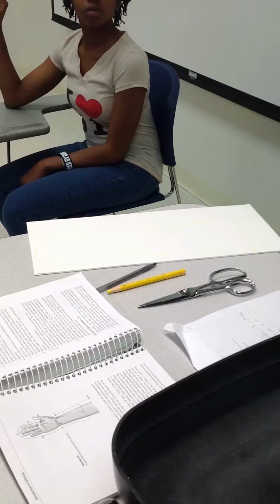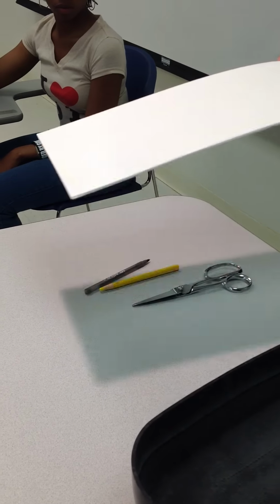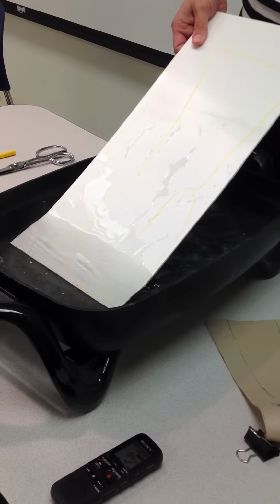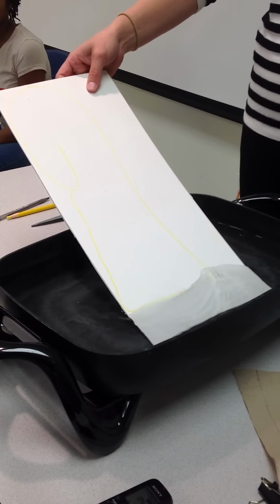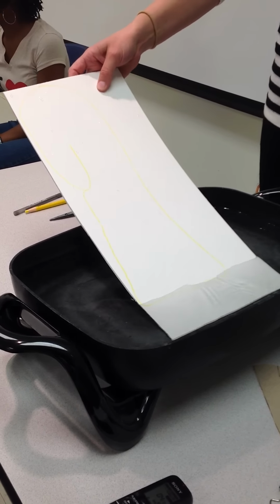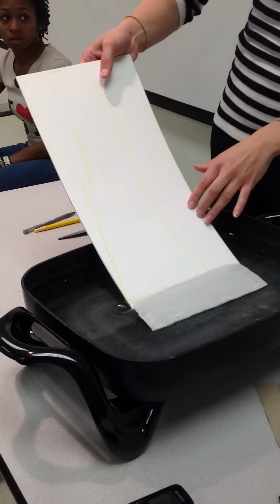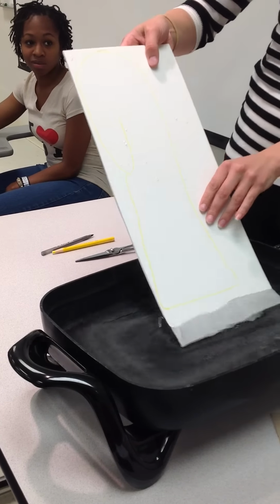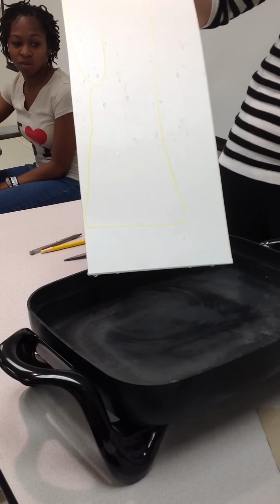Now the little splint pans, we're not going to use today. We've had issues with them making things real sticky, but you got to have a big splint pan because even this one isn't going to fit all the way. So what I'm going to do so that it does, I'm going to soften that end up, and then cut it off, and then I'll be able to put the whole thing in. If these were my scissors that have just been demolished over 5 years, I would just cut it off, but since they're your new ones, I'm not going to do it wrongly. Just a little bit.